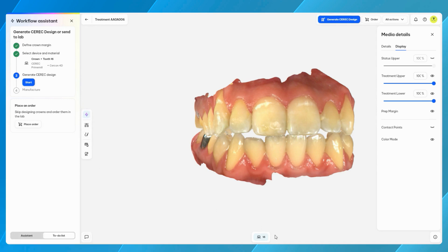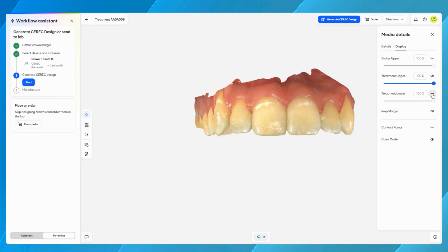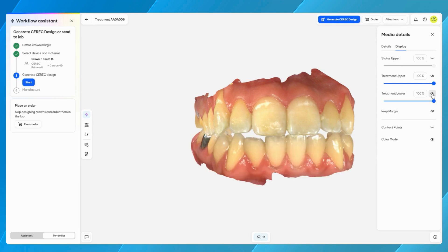On the bottom centre of the screen is the Restoration Selector, which allows you to conveniently switch between teeth in cases with multiple restorations. To maintain a consistent look and feel across the interface, the media details — including display panels and case-specific information — remain positioned on the right side of the screen.